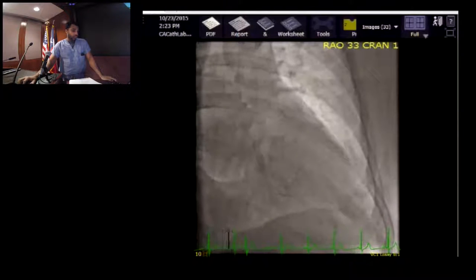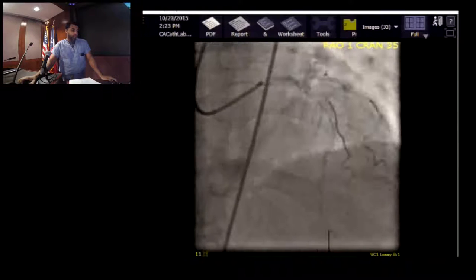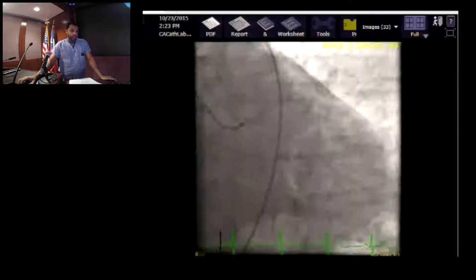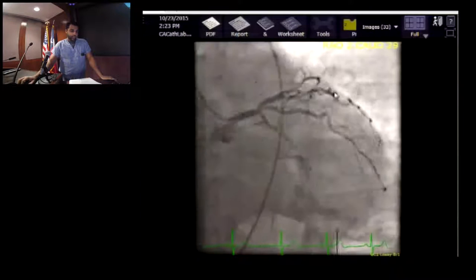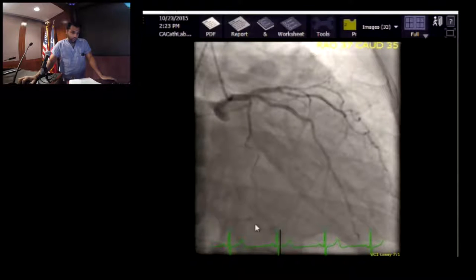Looks pretty normal. So, this is where we start getting into more diagnostics, which is kind of the crux of our presentation. But I think it's important that we identify the disease prior to going through that. I think this kind of lays out the disease the best, one of these shots here. So the disease that they were most concerned about is here, and what I believe to be the LAD coming down here. They felt that there was a lesion here of probably intermediate significance, and also some in the first diagonal.